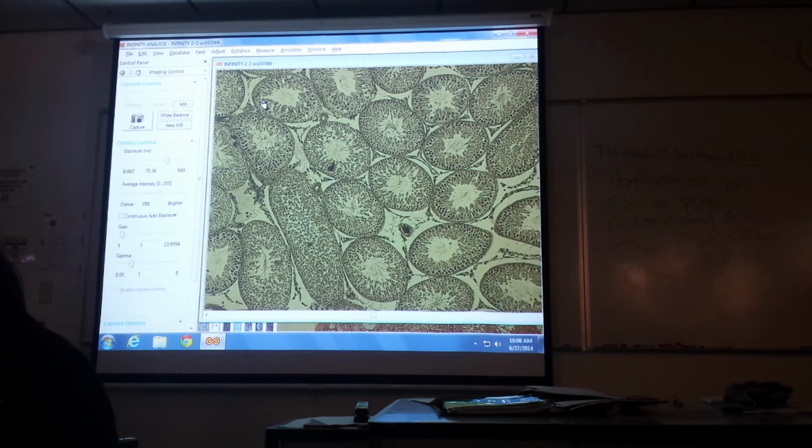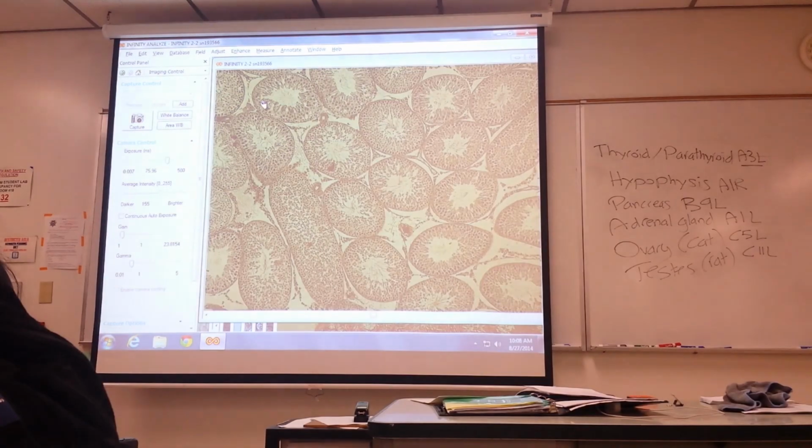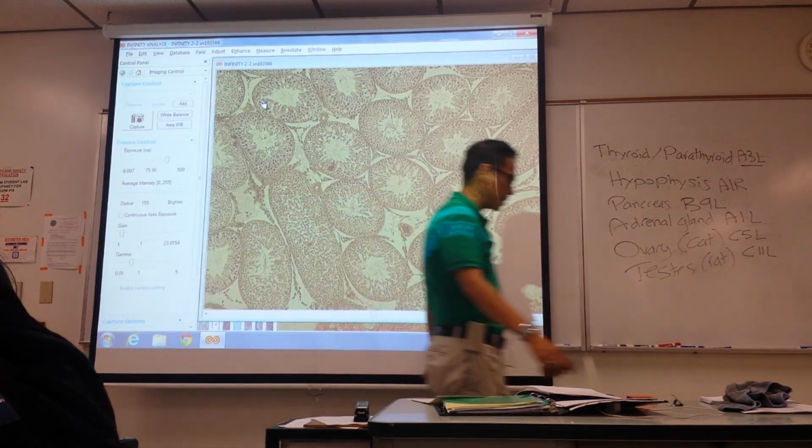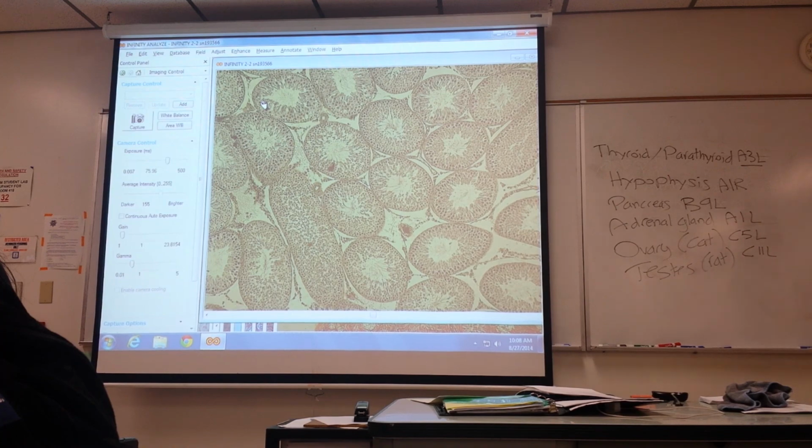Okay. Now, to give you some background on this, that's testes. They're just little marble-sized, grape-sized, circular gonads, right?